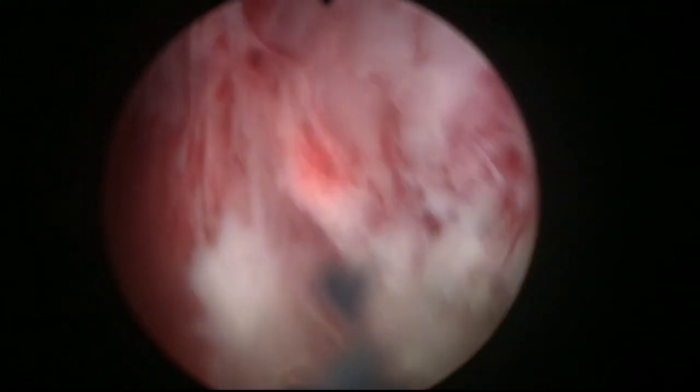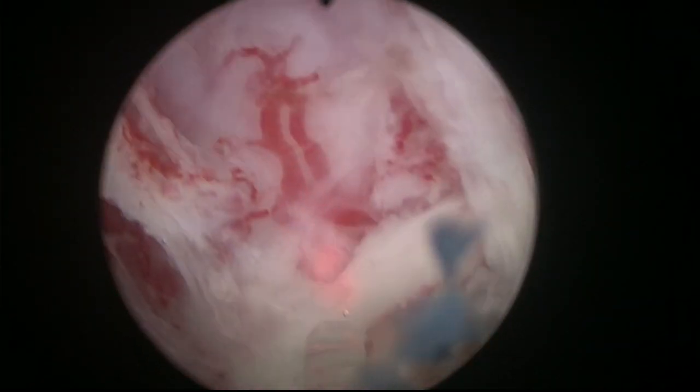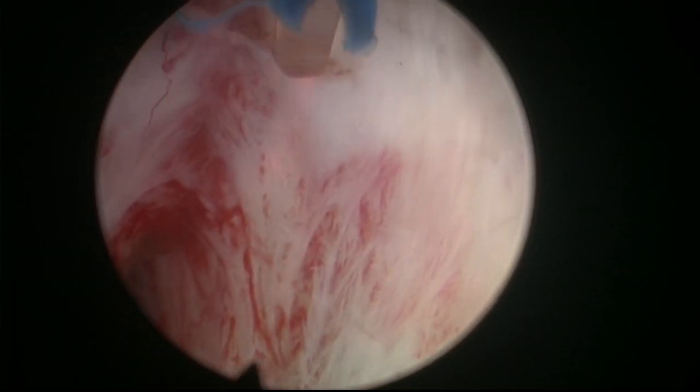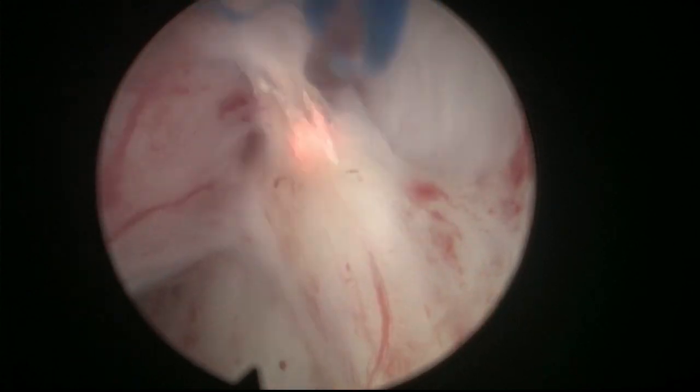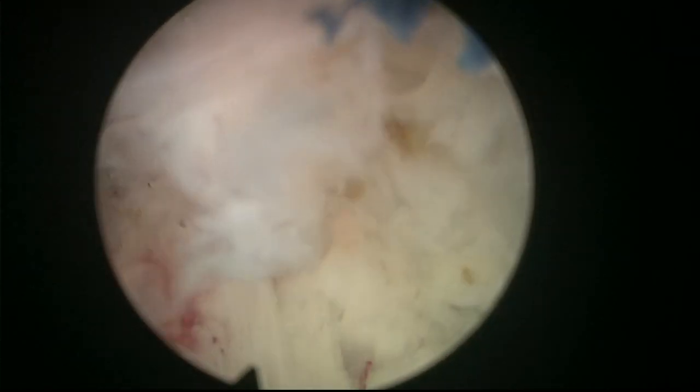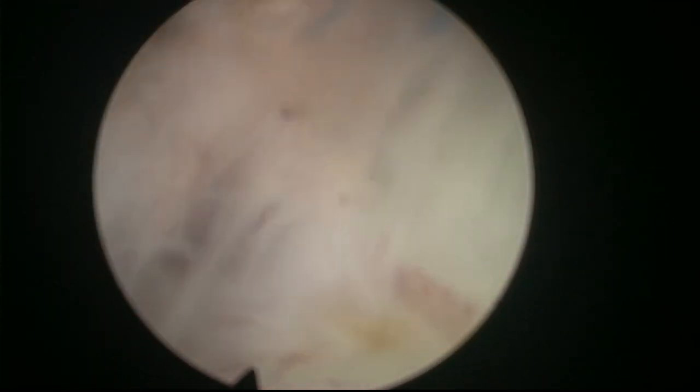This is a little bit of the sphincter here. Our white line was here, so I'm going to deepen a little bit this cut in the white line and follow the contour of the sphincter from below towards the anterior part. I'd rather do it with the fiber at 12 o'clock. I'm coming up a little bit and staying here. What I want to do is reach the anterior aspect from below — carefully coming up. Instead of going all the way deep here, I want to look at the sphincter first. The tissue is white, so we've been there before — no danger for the sphincter. Now I'm coming upwards towards 12 o'clock, already connecting with the 12 o'clock incision I made before.